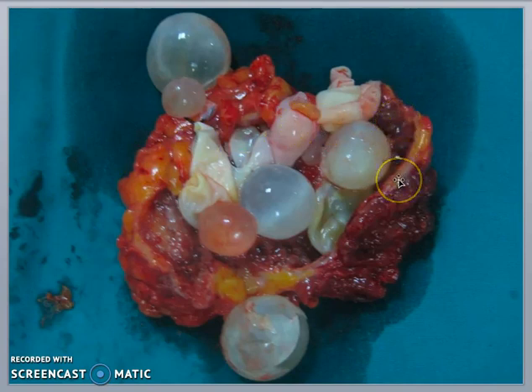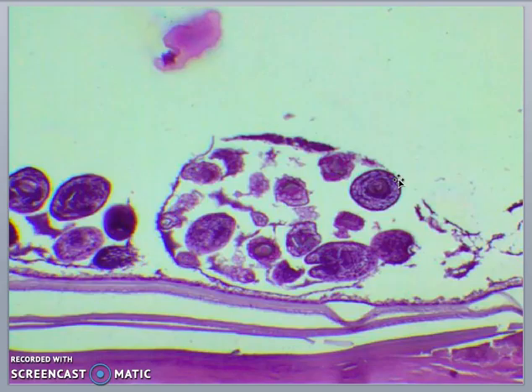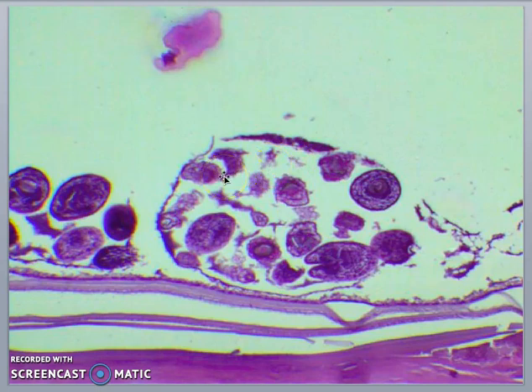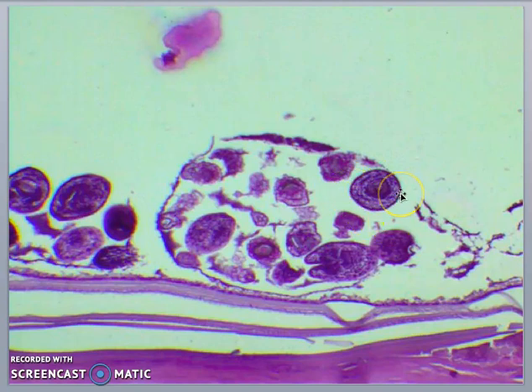The cyst contains a thick outer noncellular membrane which covers the thin germinal epithelium. From this epithelium, cells begin to grow within the cyst. These cells become vacuolated and are known as brood capsules, which are the part of the parasite from which protoscolices bud. Often, daughter cysts also form within the mother cyst.